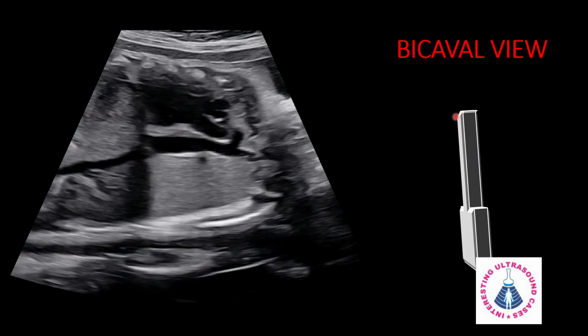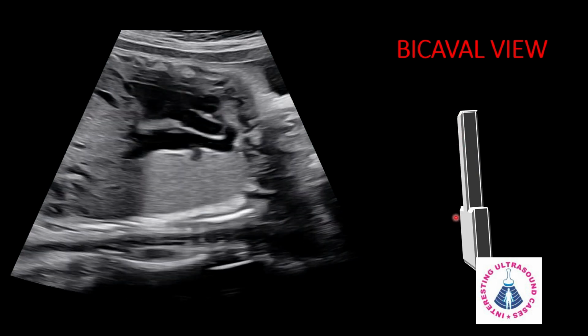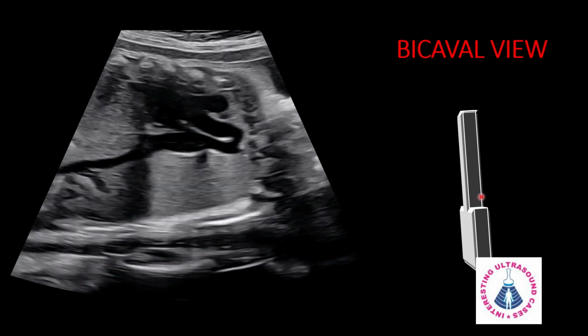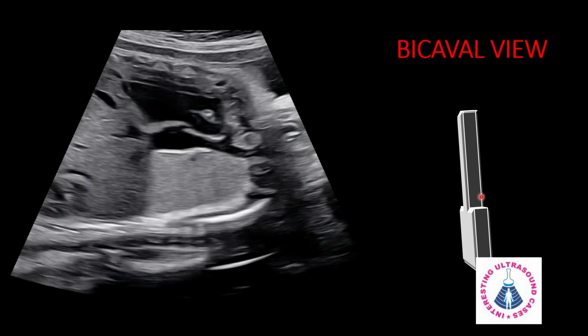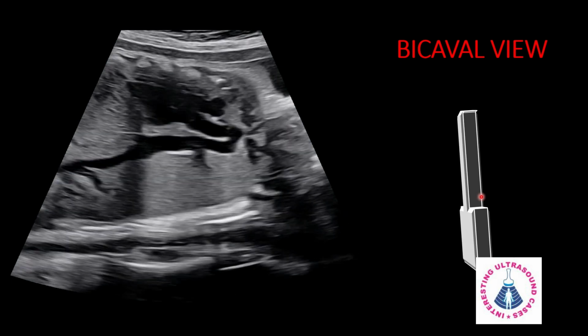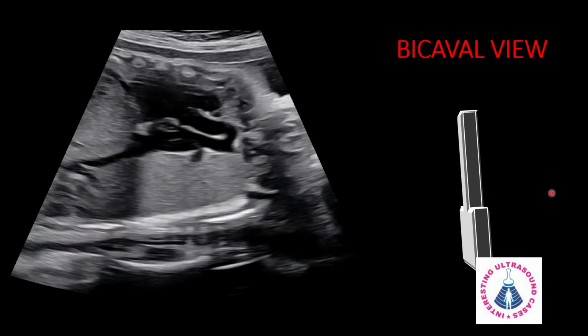It can also be viewed in the sagittal section of the fetus by rotating the probe 90 degree from the 4-chamber view. All these 3 views, that is aortic arch, ductal arch and bicaval view, are obtained by little bit manipulation in the sagittal section.